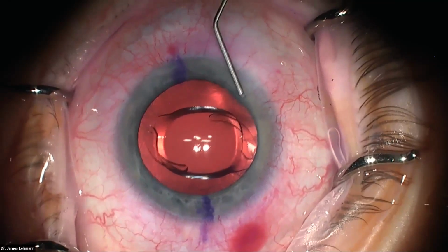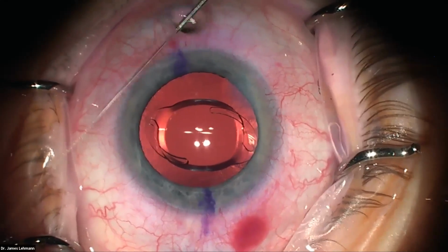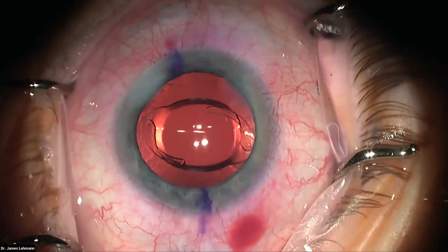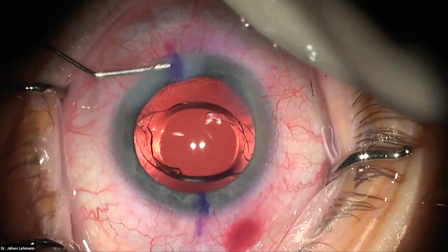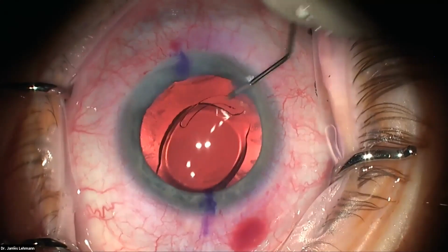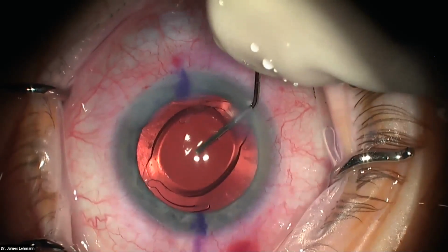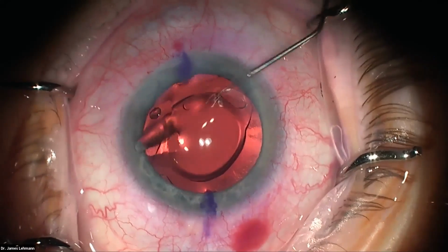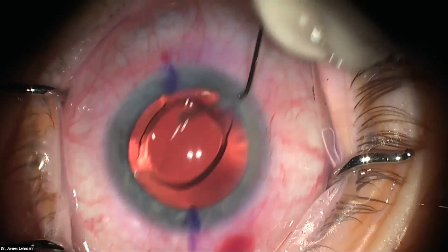This is the moxifloxacin. I'm going to put it in my side port incision. And then this is BSS on my 2.6 millimeter incision. I'm going to do the stromal hydration. Okay, so now I'm going to make sure that the lens sits back and that it's completely covered by the rhexis that we made. So I'm just gently injecting, keeping the AC deep. So now we're nice and centered, except I don't like that haptic that hasn't come unfolded yet. So I'm going to go in with, there we go.